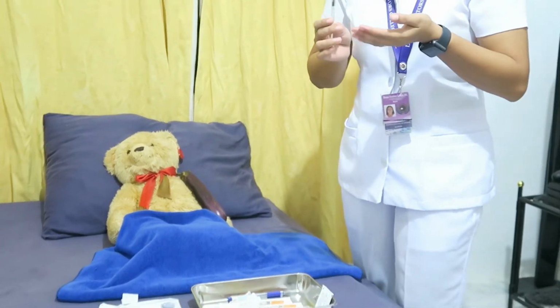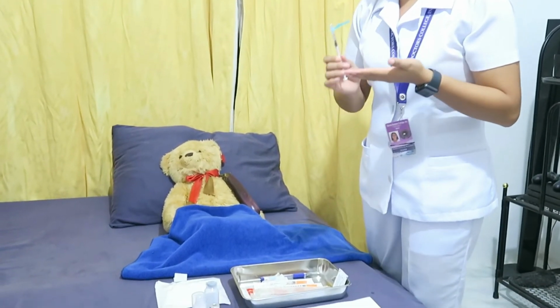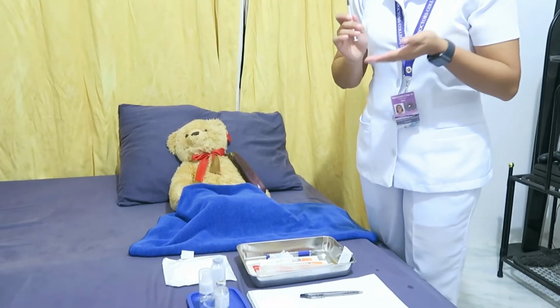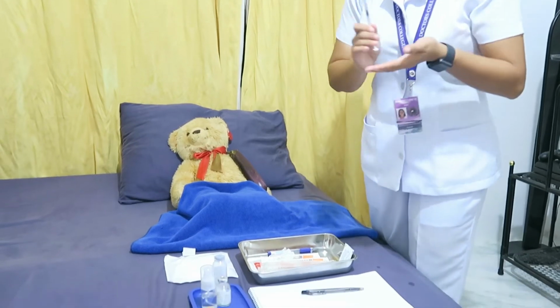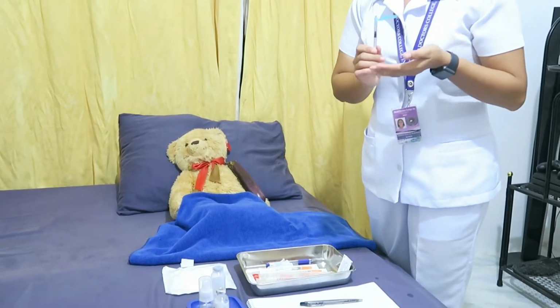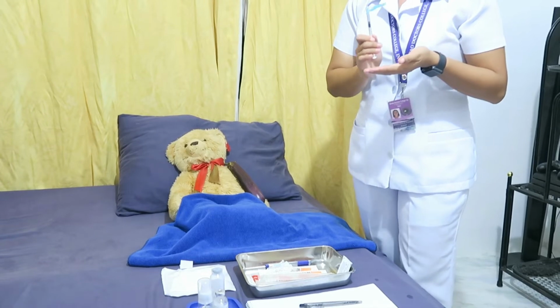After that, the rationale for this is the air will allow the medication to be drawn out easily because fluids move from an area of greater pressure to an area of lesser pressure. The bevel is kept up to avoid creating bubbles in the medication. Withdraw the prescribed amount of medication using either of the following methods. The rationale for this is to encourage client cooperation and reduce apprehension.